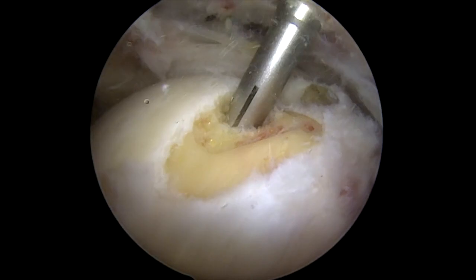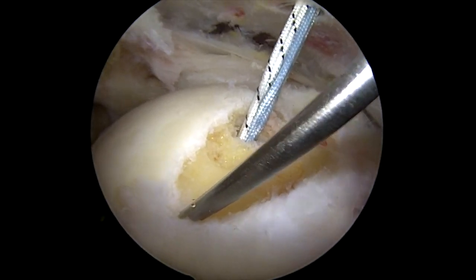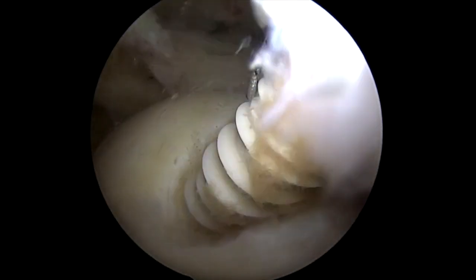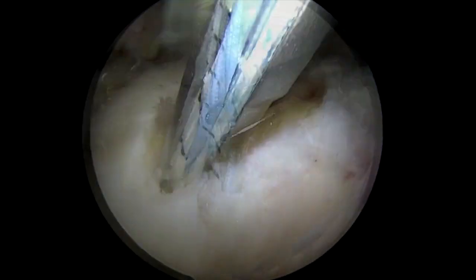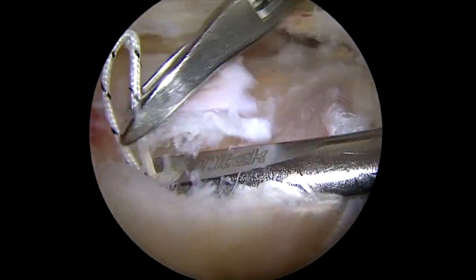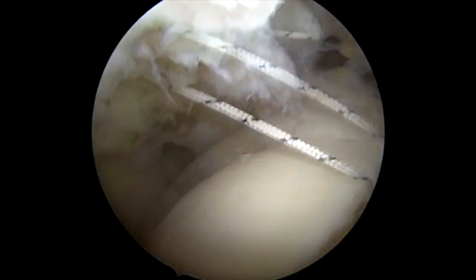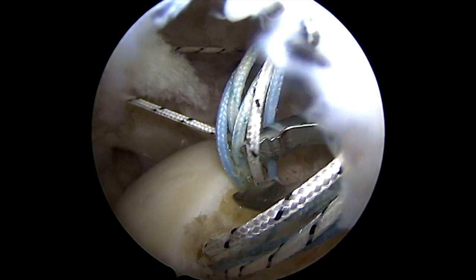These are special tendon repair sutures that are reinforced. I've got two anchors here that we're going to place, and then we'll pass those sutures through the tendon, and that's going to bring the tendon back down to the bone. So both of our anchors are in here now, and then you'll see me quickly grabbing one suture at a time, carefully placing each one through the tendon. I'll use this instrument to pass the suture through the tendon and then grab that from the front, repeating this process for all 12 of the sutures. You can see once I pull that, it brings the tendon right back down to the bone.